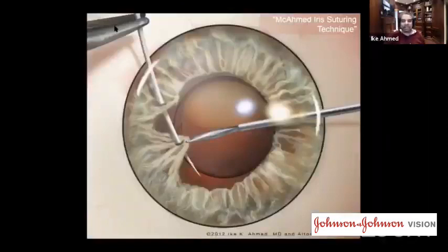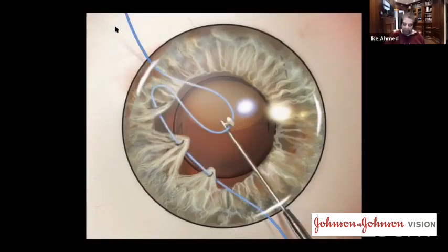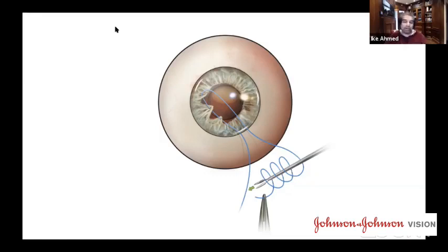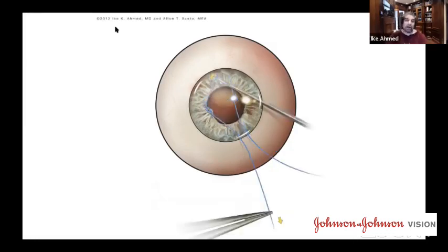What we're using basically here is a suturing technique. We're using a micrograsper to grab the iris. We are coming out of the incision, taking a Kuglen hook to bring the suture out of the incision. So now we have two ends out of the eye. Very similar to what we've seen with the Siepser sliding knot and the four-throw pupilloplasties we saw earlier. Here we're using the microtier to actually suture around the short end of the suture, long end of the suture, grabbing the short end, just like we would outside the eye, and then pushing it into the eye. This is a very reproducible, easy technique to use. There's no worry about looping the sutures and moving the suture in and out. It's simply looping on the sutures very quickly and pushing it into the eye, very straightforward. And then cinching it down, and whether you do a four pass or whether you like to do a locking suture, this can be done.